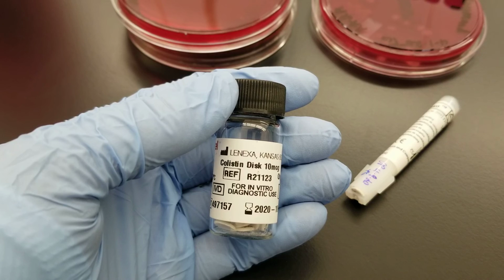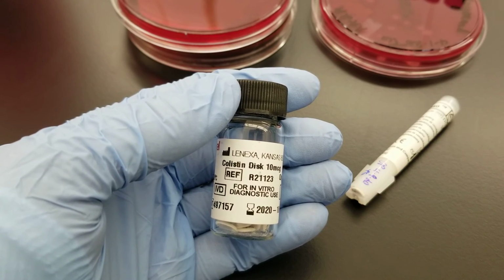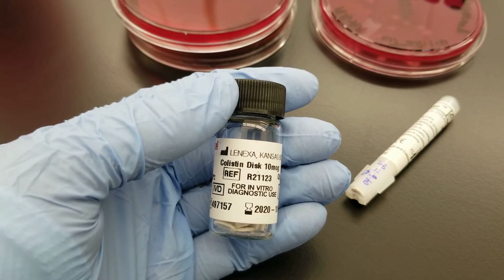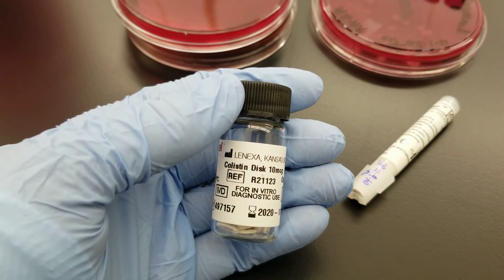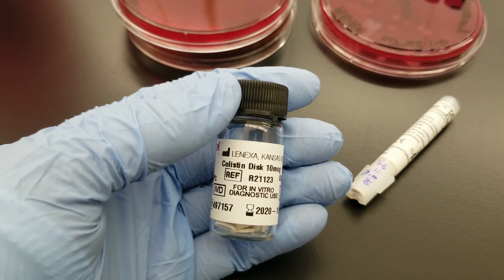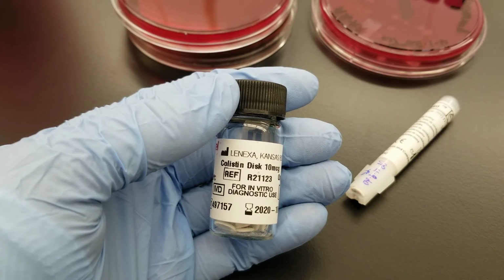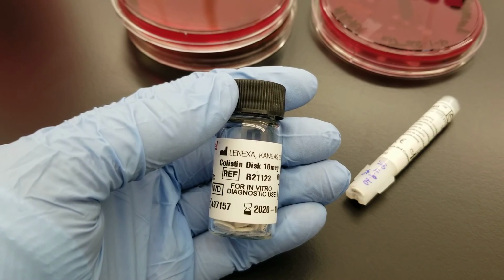And so most of the time you're not going to end up having to put it on the Vitek for susceptibility testing, but there are some indications that you might have to do susceptibility testing of your anaerobes, and those are site-specific. You would follow your clinical site's or facility's standard set of operations.